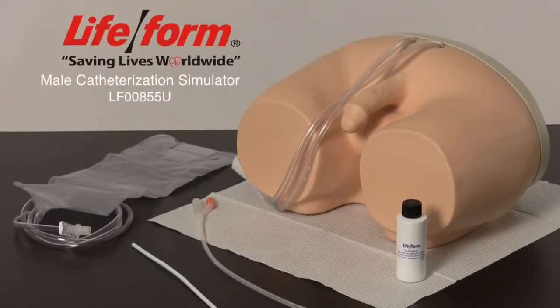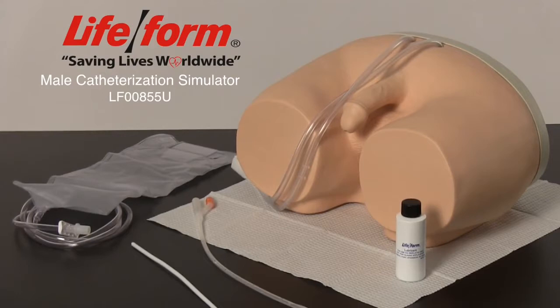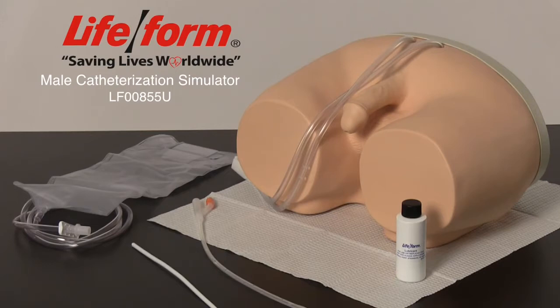The Lifeform Male Catheterization Simulator is designed to duplicate the human condition as close as plastics technology allows. This video will assist users in the function, care, and maintenance of the simulator.